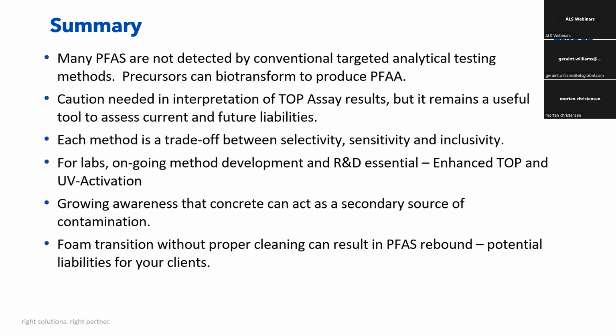From a lab's point of view, ALS, like many of the labs, is involved in a lot of ongoing method development. Obviously, research and development is essential. We're looking at advanced oxidizable precursor methods. We're starting to look at UV activation as well.